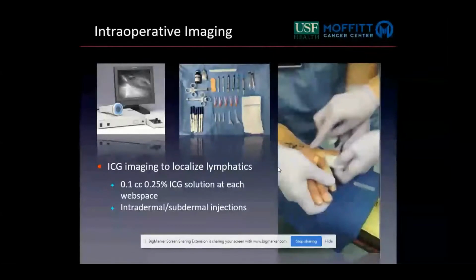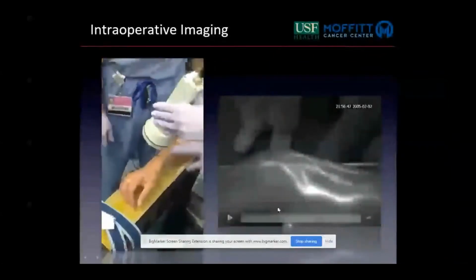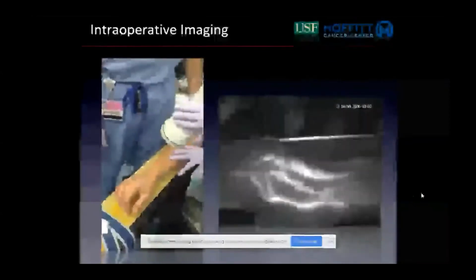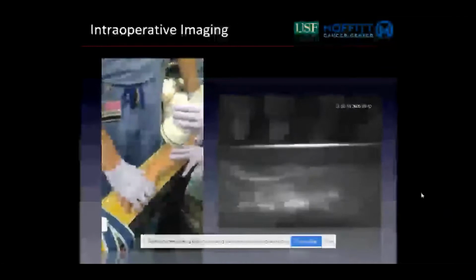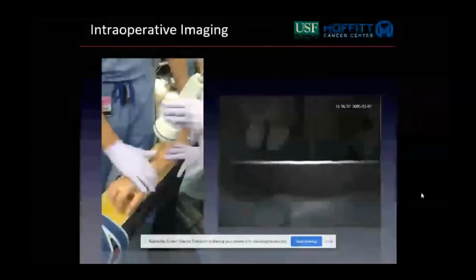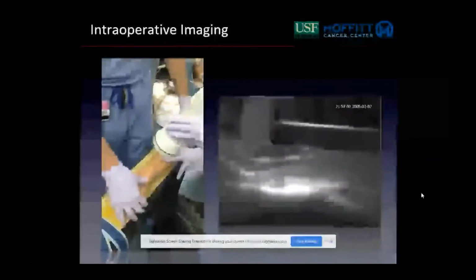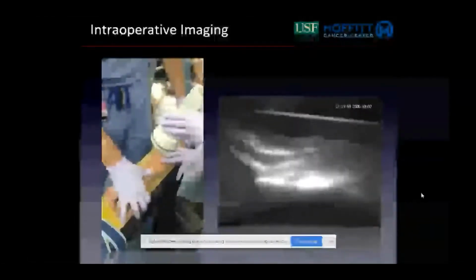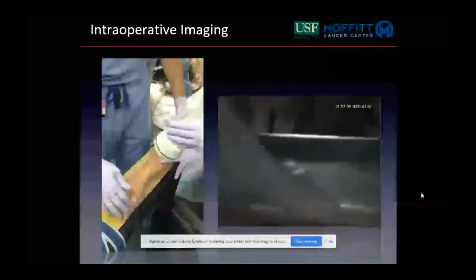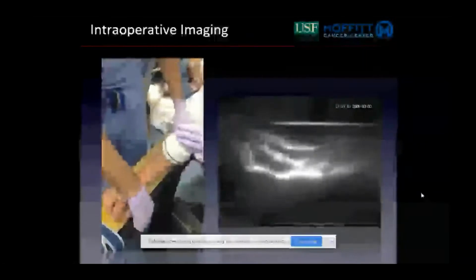Next slide. And if we can play both of these videos here, what you can see is this is what ICG lymphatic imaging looks like in the operating room. So you can see on screen left, we have just white light. This is me performing some gentle lymphatic massage, paired with what this looks like underneath the ICG imaging camera. And you can clearly see the linear lymphatic channels distal to the area of obstruction that allows us to identify where we're going to make our incisions, target our lymphatics for lymphovenous anastomosis.